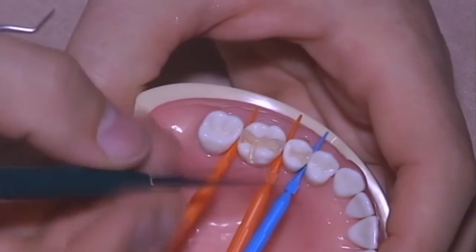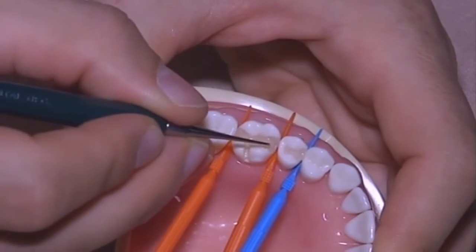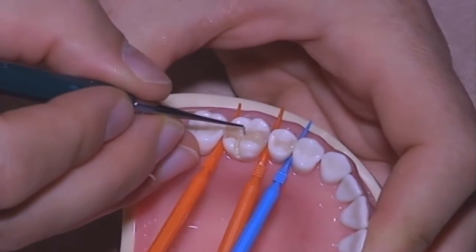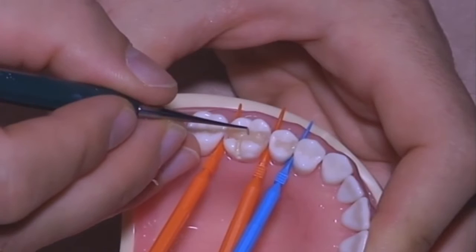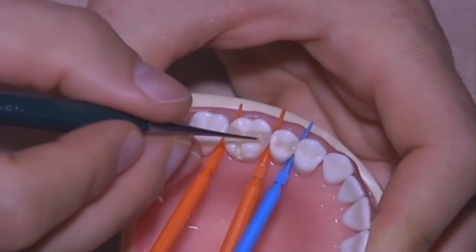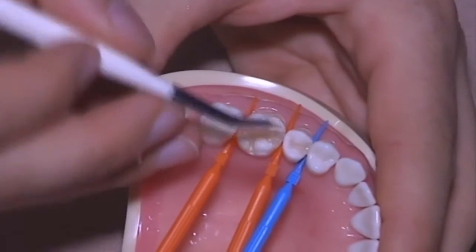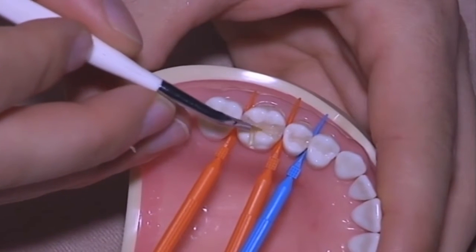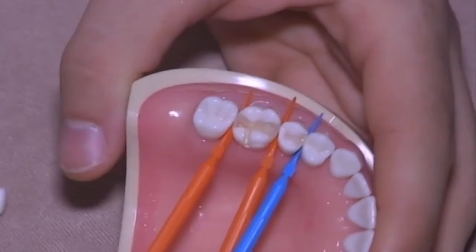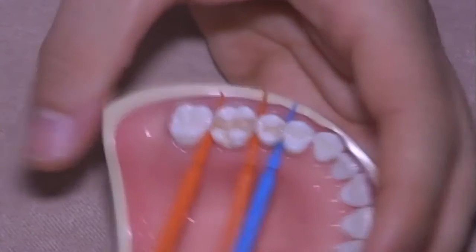And then with little points, beginning to give the anatomy. Here we are.